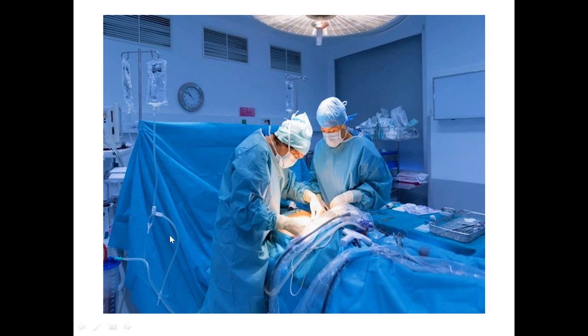You can't see the anesthetist here, but this is the suction, where whatever is being sucked through the tube is going into suction. You can see some material there. Then the bags of IV fluids are hanging, which are running. This is what you require. And obviously the top light is just illuminating the area which you want to operate in, a clock that tells you how much time is taken, central AC, and a view box for the X-ray. So that's the usual operation room.